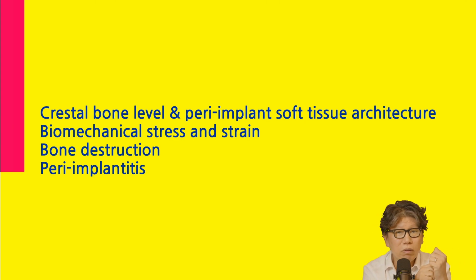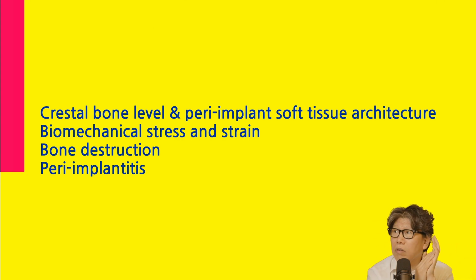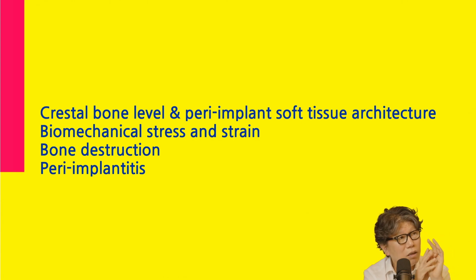And think about it. The only countries that have companies that produce titanium are the United States, Germany, and China. I guess you have to have a furnace to remelt the titanium. I use very little from China. It's almost all from Carpenter in Fitchburg, USA, and titanium from ZAP in Germany. So it doesn't make sense. I mean, material is the same. Surfacing is either SLA or HA.